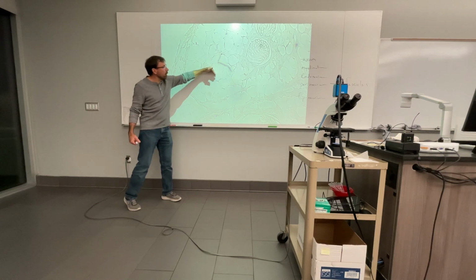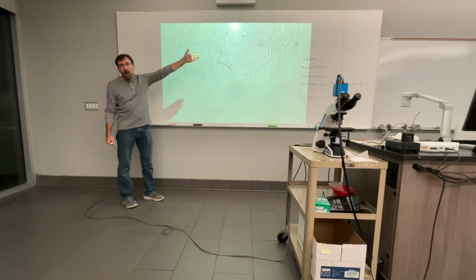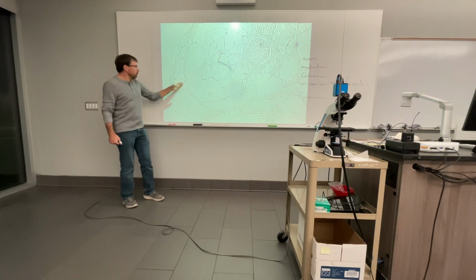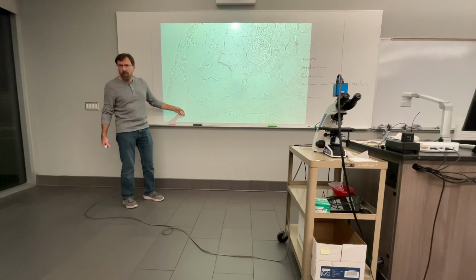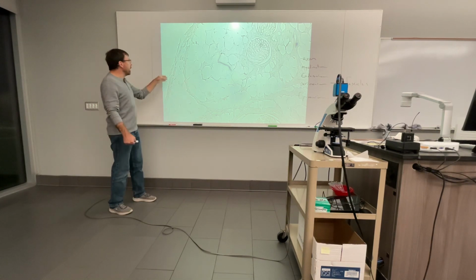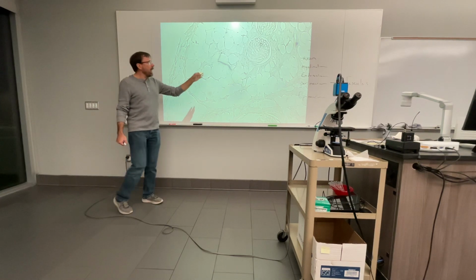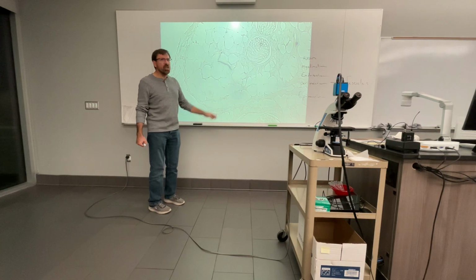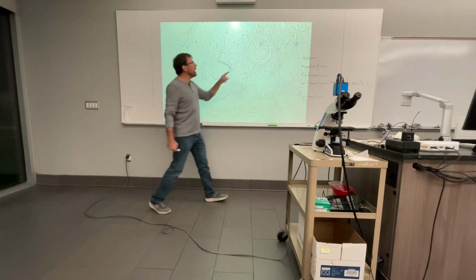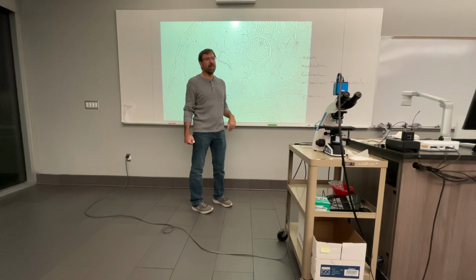Epineurium, basically, we're going to call it that as long as it's extending away from a fascicle and there's not another fascicle sitting there. You see what I'm saying? That's why I don't want you going from outside in, because you say, oh, epineurium, perineurium, and then you go, I've got too much stuff. So going from the inside out is the better reference frame to use. Does that make sense?